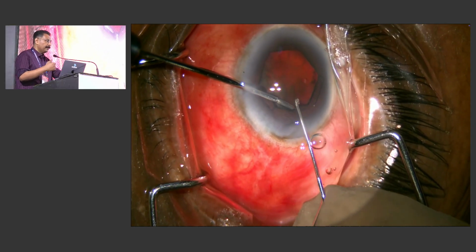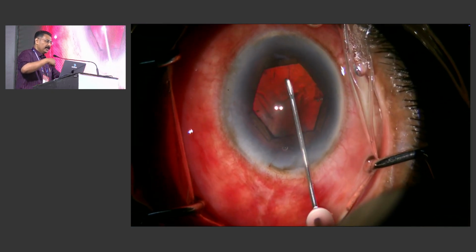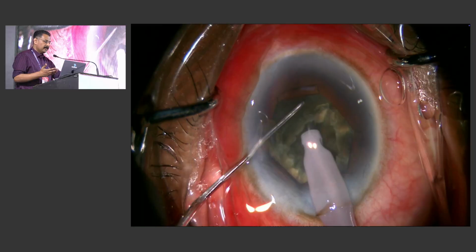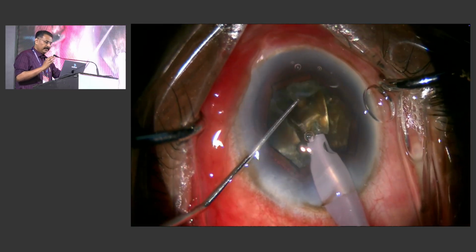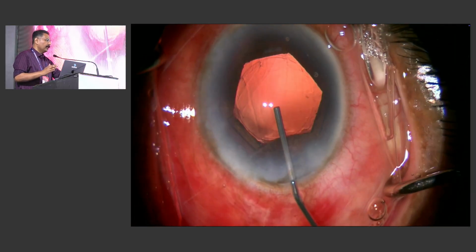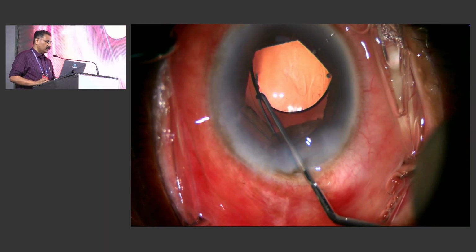So, retracting and pulling. You can partially pull and partially retract the iris so that a very gross movement is not required. So here you have a wider pupil and this is a very hard cataract. Even if it is 5 millimeters or 4.5, they are bound to come down during your procedure. That's what I have seen. So you have to retain. This is what I was telling.